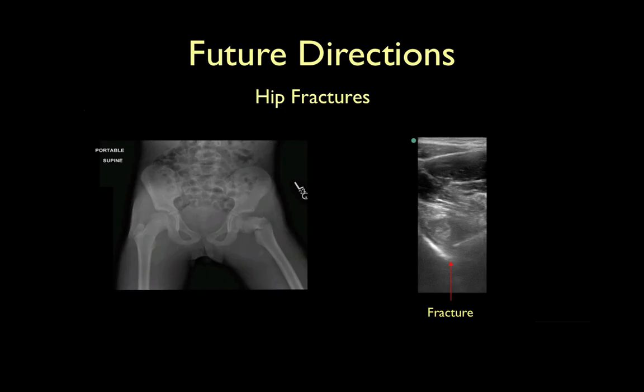We've discussed the primary applications of hip sonography in the emergency department to identify an effusion and guide arthrocentesis. Other applications, such as fracture identification, may be feasible with sonography. This 10-year-old male's left intertrochanteric hip fracture identified on X-ray was also evident on ultrasound. Notice the interrupted bony cortex of the femoral neck.